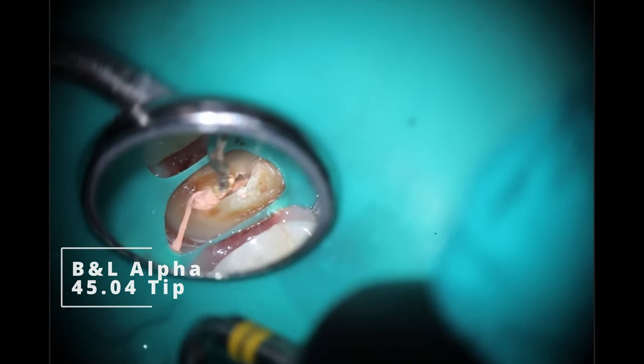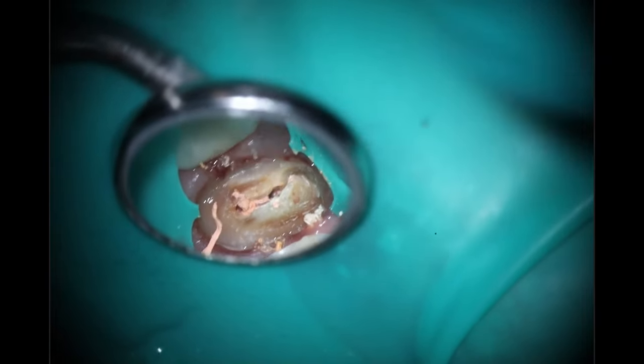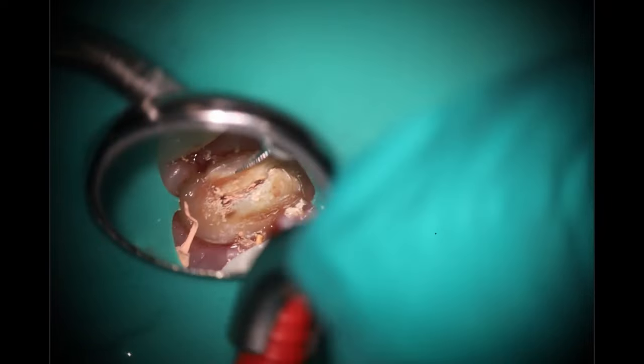Going in with the alpha to start to create that post space. As usual, I'm going to have problems with stuff getting in between the isthmus, so I'll go in in a bit and use some hedstroms to clean that out, making sure there's no gutta-percha up top. Cool trick — you can use the alpha to actually melt the rubber dam. I knew I'd be doing the buildup, so I'm planning to create a flush parallel surface all the way up and let the dentist choose how deep of margins they'd like for the crown prep. If I'd left the rubber dam in that area, it would have just got caught on the spinning rotary.